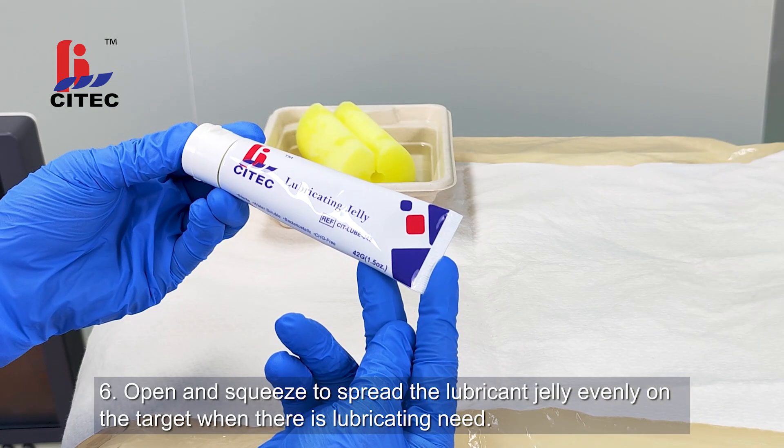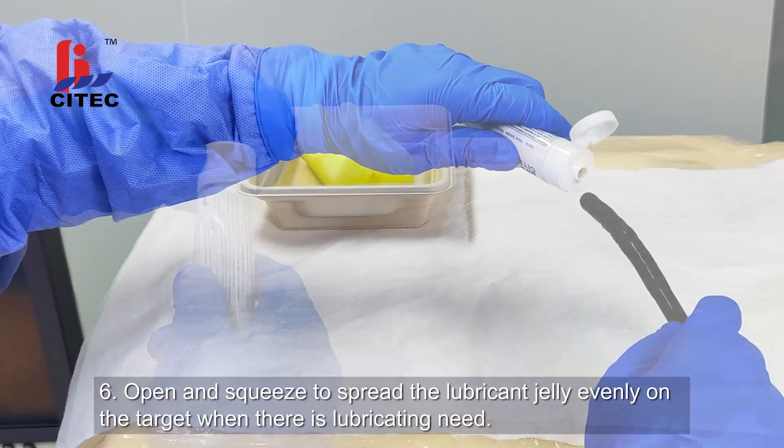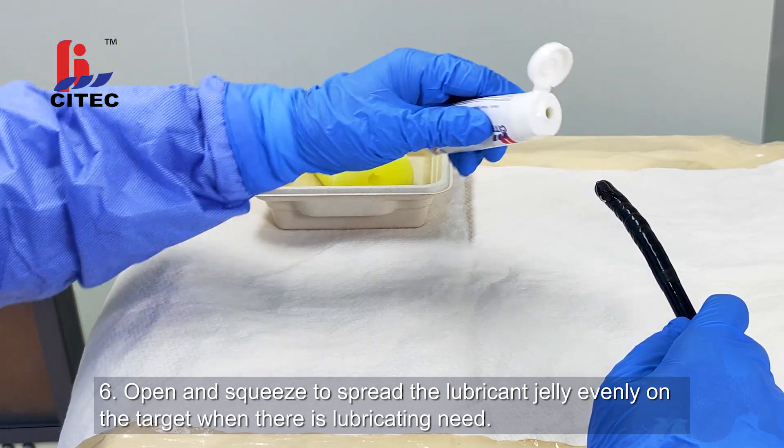Step 6: Open and squeeze to spread the lubricant jelly evenly on the target.